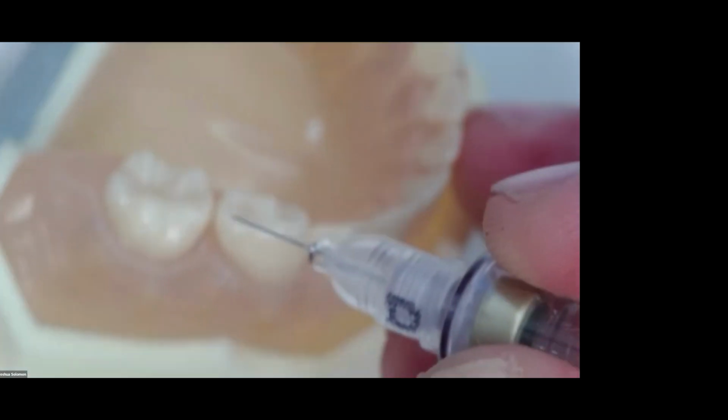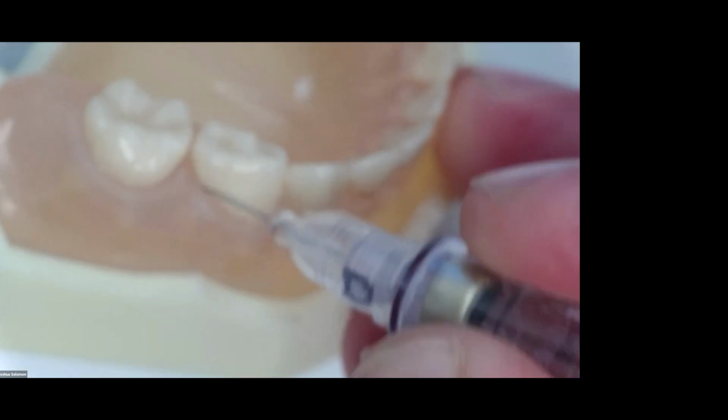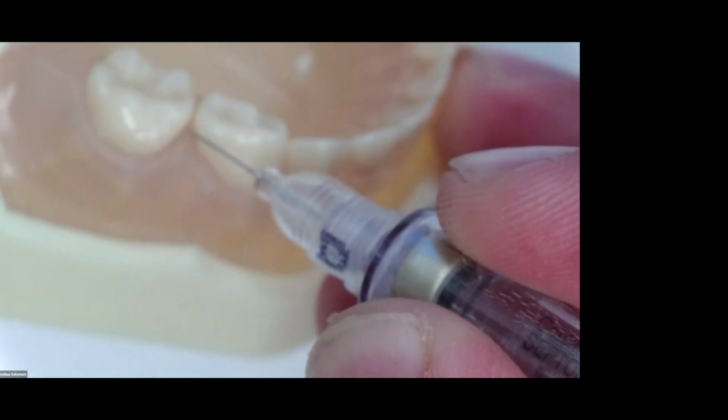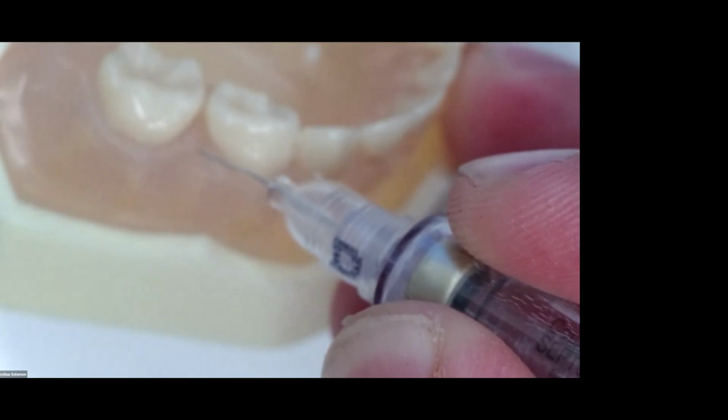So I'm coming in, my D is facing out. I'm at about a 15-degree angulation, and I start. If you remember, we talked about the middle of the papilla. I'm going to split that papilla in half, and then I'm going to go just slightly mesial to that.